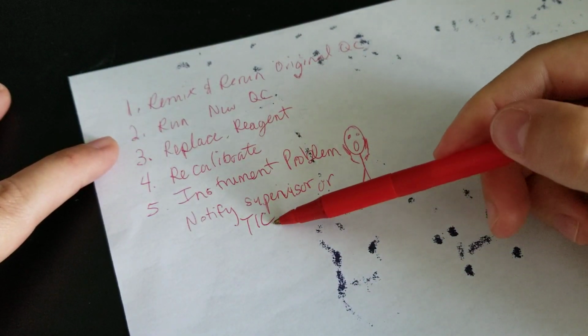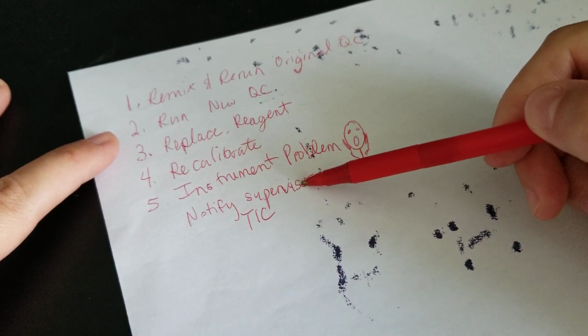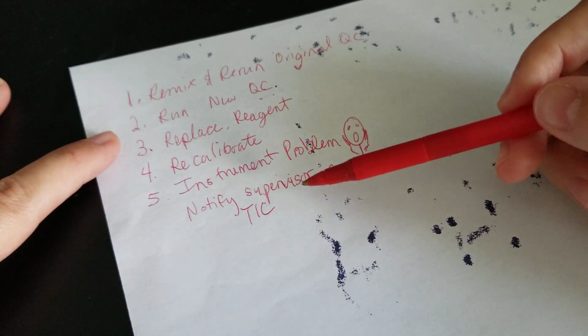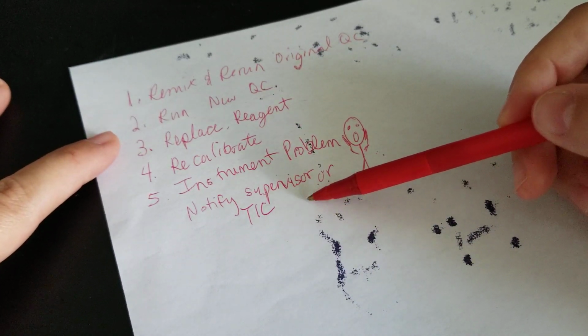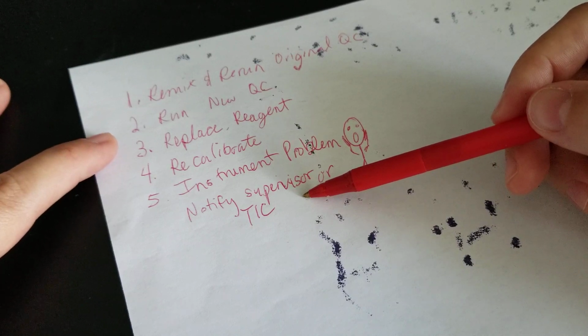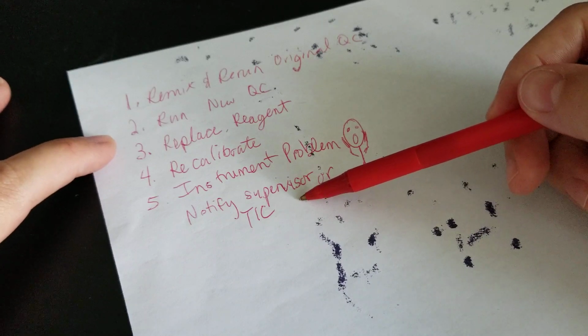That's an MLS that is in charge of the section, maybe while the supervisor is out or on break. Okay. So notifying that person to make sure that they know, hey, I'm going to have a little bit of a backup right now on my analyzer. I'm in the middle of maybe having to do some kind of maintenance because the other shift didn't do it, or I didn't realize that was due today or whatever.